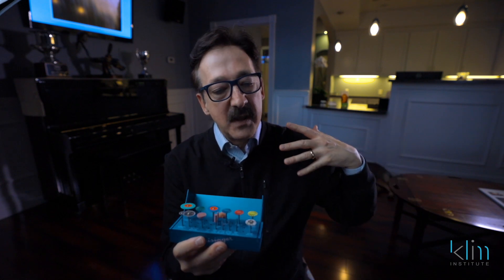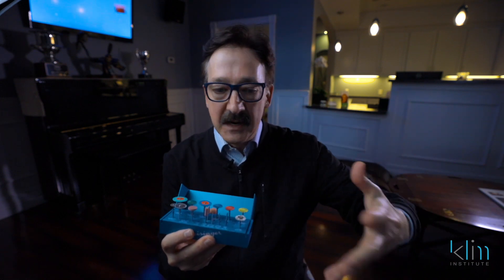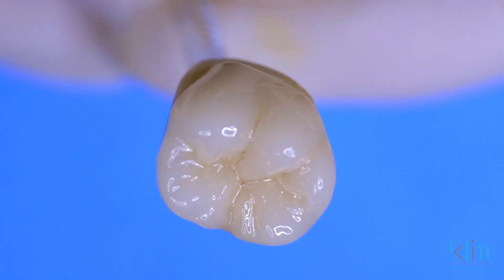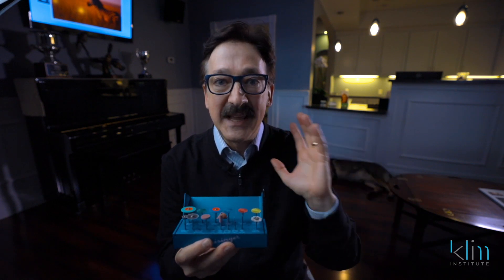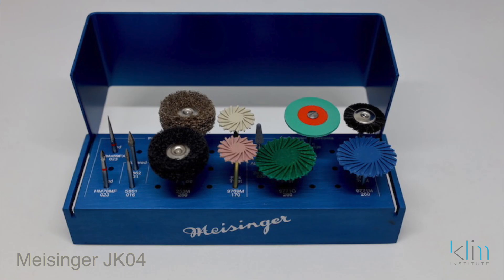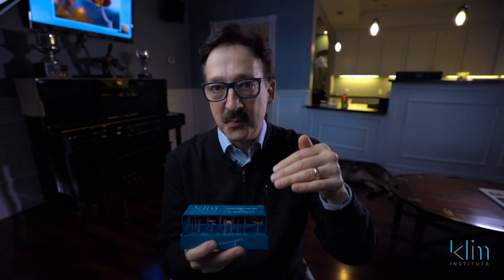In most cases, we want that surface not to be too smooth so that when you place the glaze on it — and the colors in the glaze — it infiltrates and infuses into that outer layer of your ceramic. You don't want to over-polish that, and it will create a really predictable finish. So once you're done with your glaze, we can use some polishing techniques to control the superficial gloss finishing. All the ceramic videos on this site will be using the JK03 Meisinger kit. Let's go ahead and get started with the shaping process.